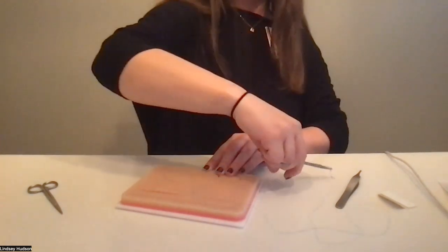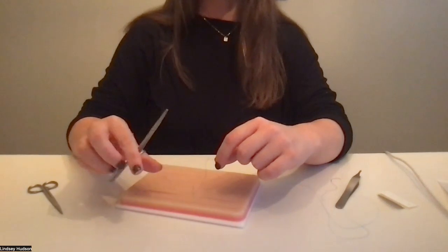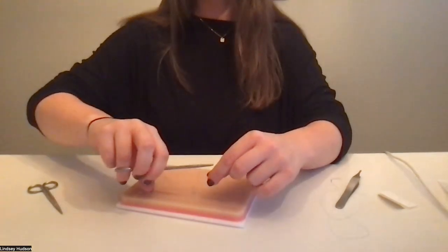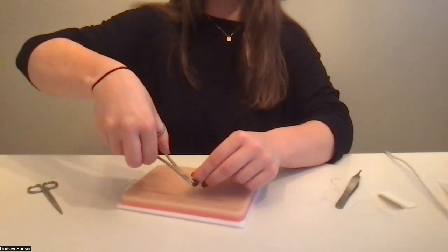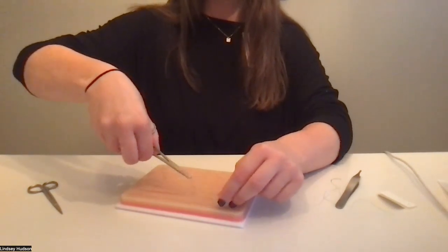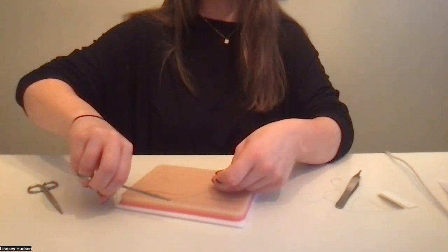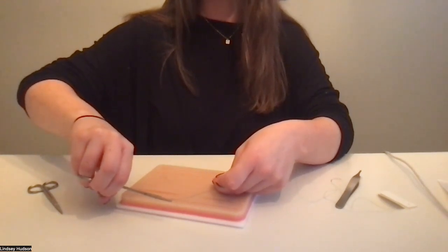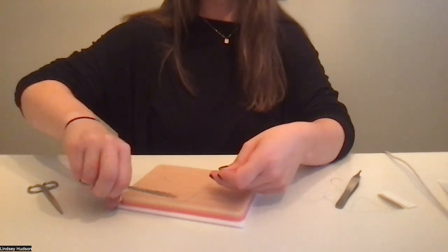So now you have to make your surgeon's knot, and you're going to take your suture and your needle driver, and you're going to twist the suture around the needle driver twice initially. You're going to grab the tail and pull it through to create your surgeon's knot to keep that suture nice and tight and to approximate that skin so that it can heal.